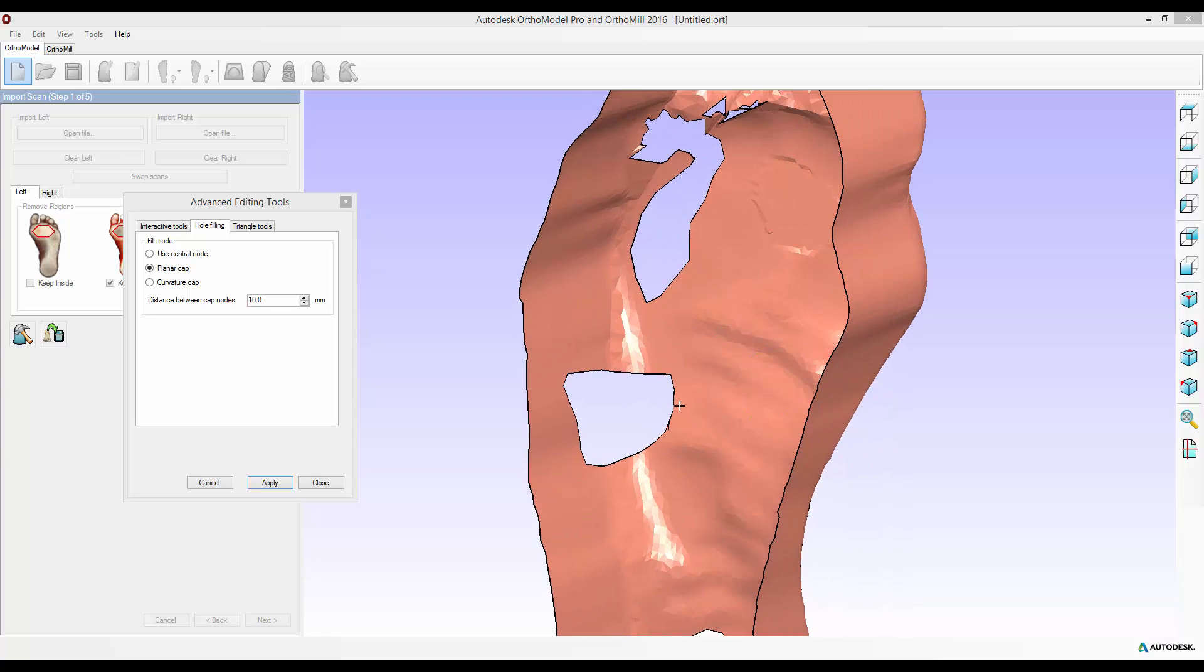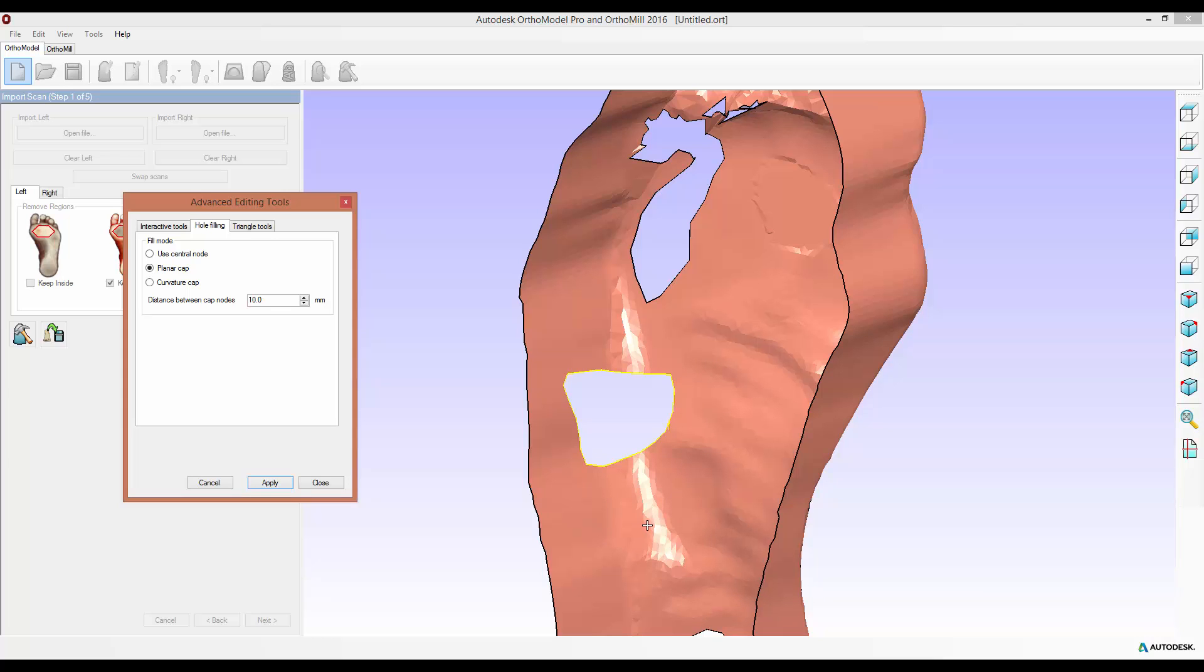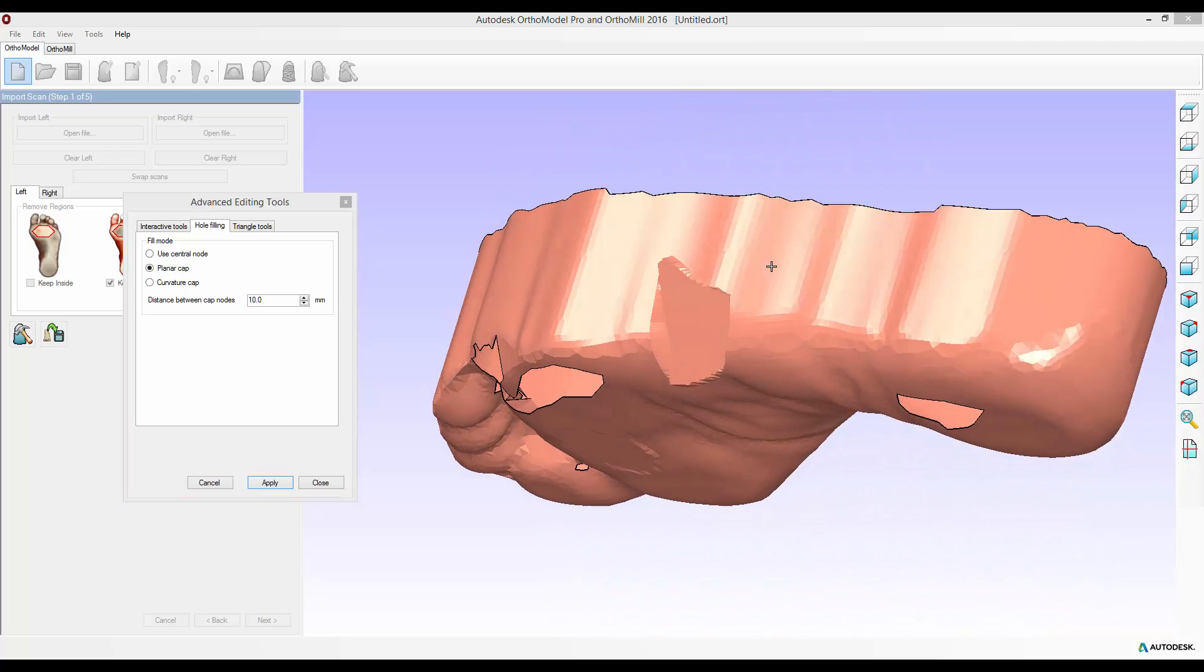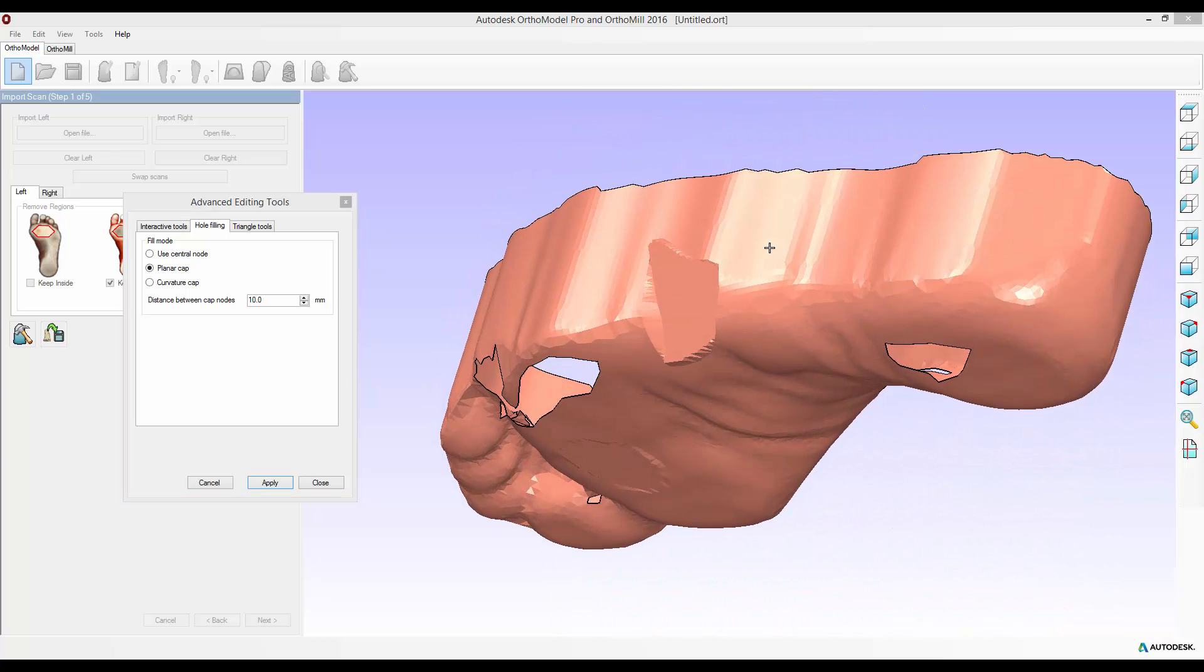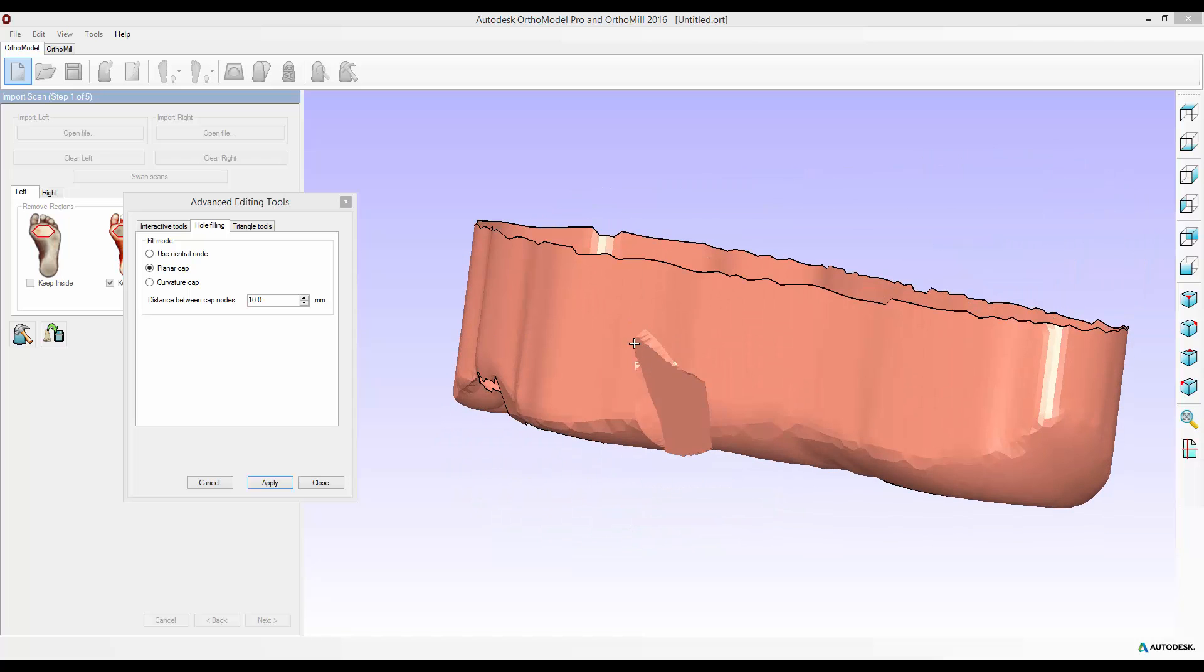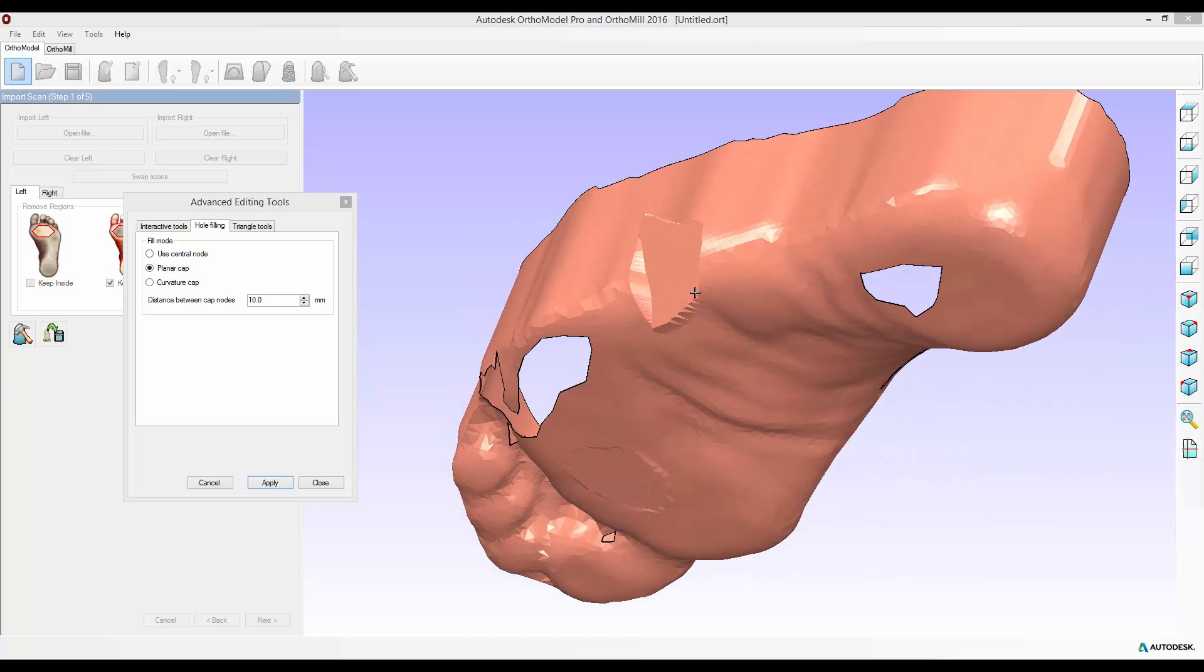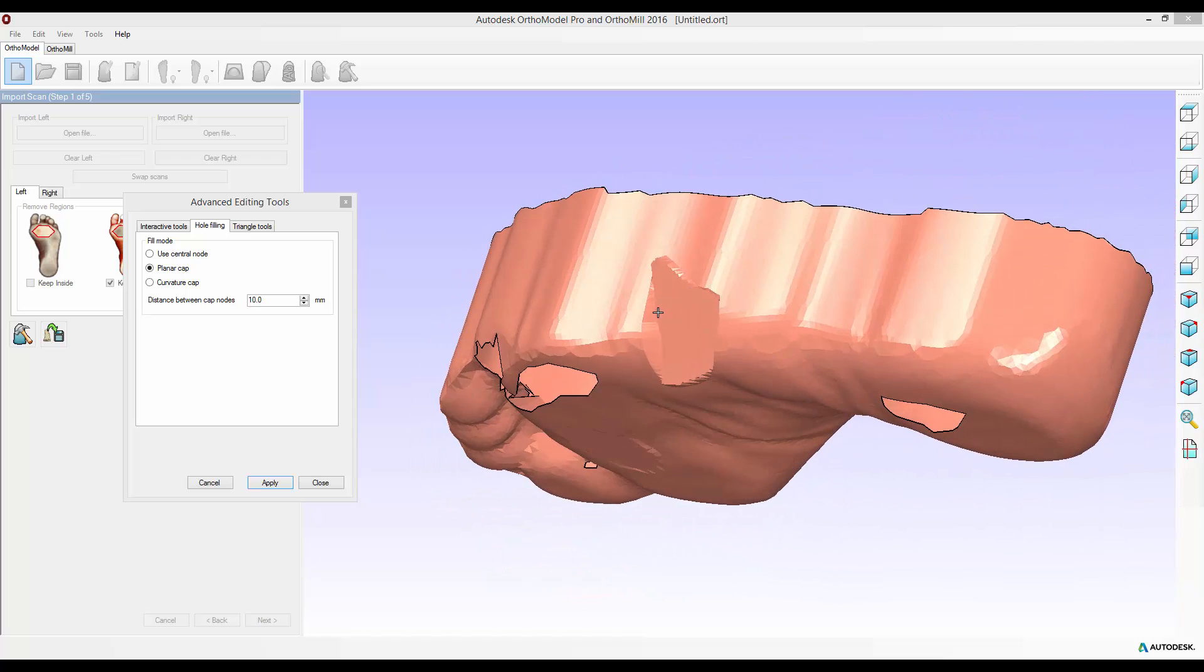However if I try and use a planar cap for a hole such as this one which curves a lot, so it's on the plantar surface but also on the lateral surface of the scan, it might not have a very good effect seeing as the planar cap only uses a single plane. I'll select the boundary, apply this and show you now. It hasn't followed the curvature of the foot at all and you can see these rough triangles at the edges where it's tried to fill in the plane to the scan.